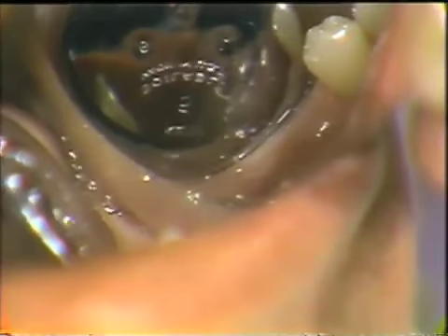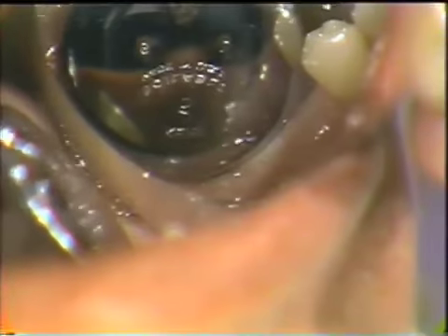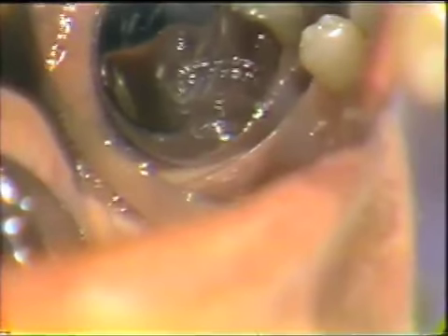The shape of the edentulous ridge is also important. If the ridge is positive and very high, you'd want to look at it for potential undercuts for the base, so that when the partial denture was inserted, it would not be scuffing the tissue.